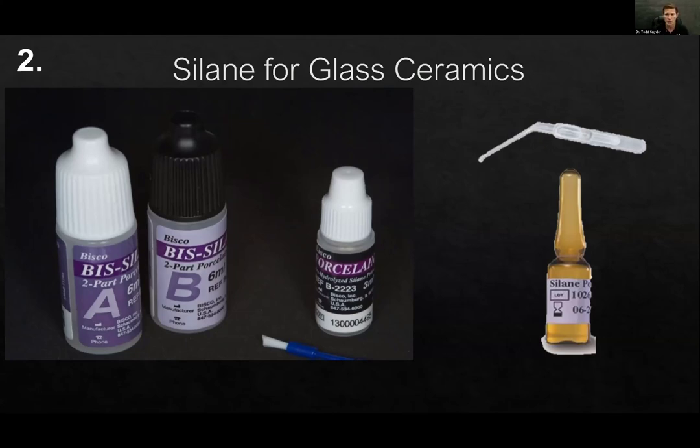You've got a single bottle system, just like the others, but it's got a lot more liquid in it, right? It's got a lot more silane. The reason there's more is so you can do more teeth, or more restorations, I should say. Now, if you say, well, hey, I don't do that many, is there something different that I could use? Maybe it has a longer shelf life.